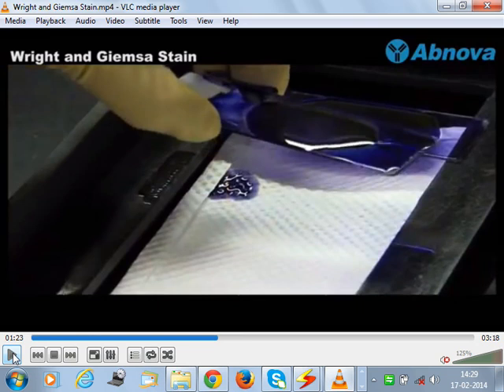So how do we find out? We have to put stain. With the stain we have to differentiate. So the purpose of adding stain, one, is it contains fixative. Number two, it contains stain to color the different types of cells so that we can identify this cell as this particular cell. Understood? Okay?